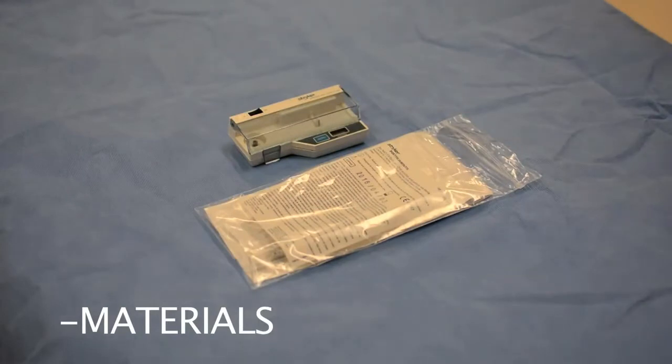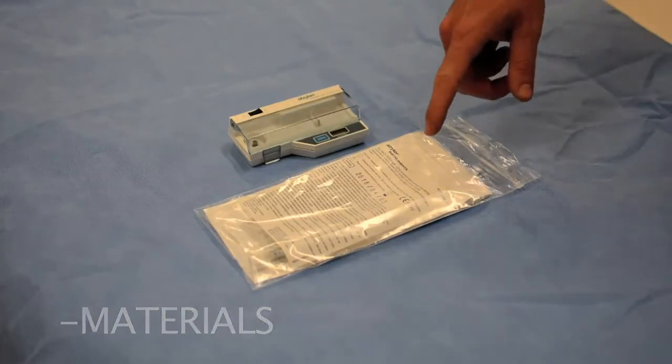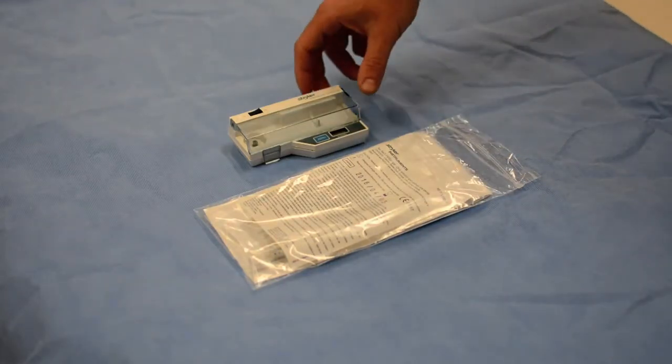Step 1 is to obtain the disposable components for the Striker monitoring system, which include the saline syringe, the pressure coupler, and the pressure housing.